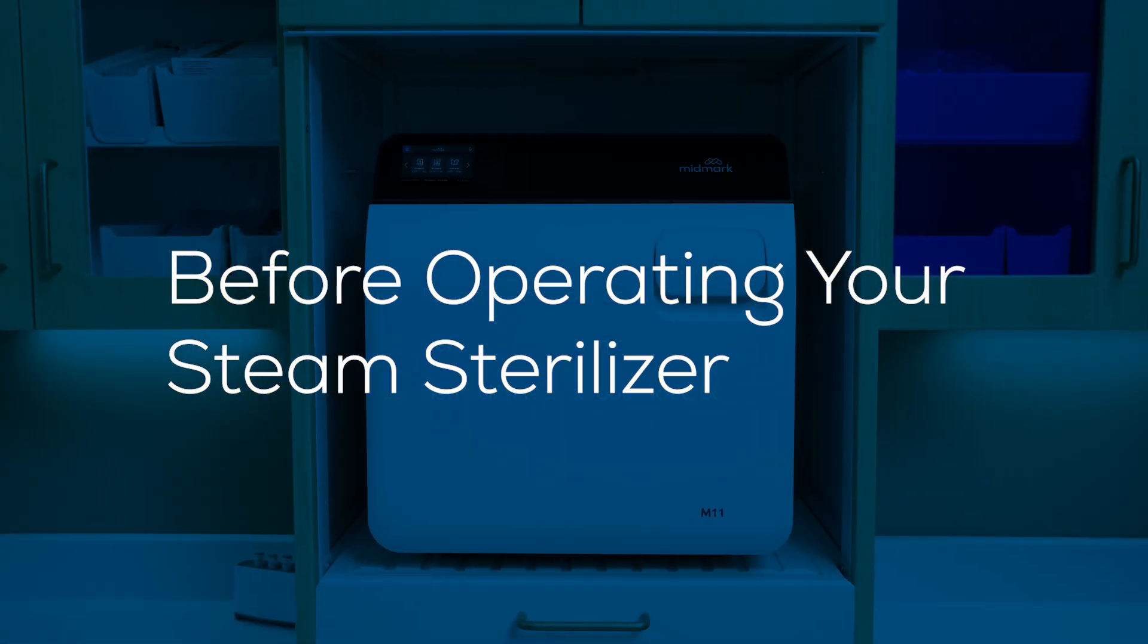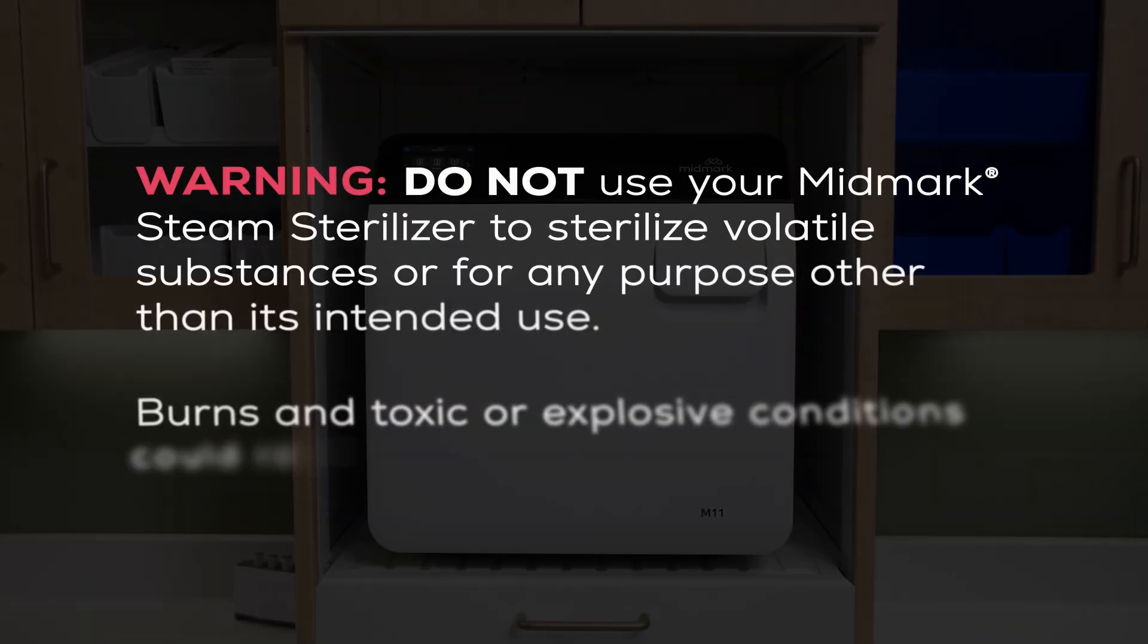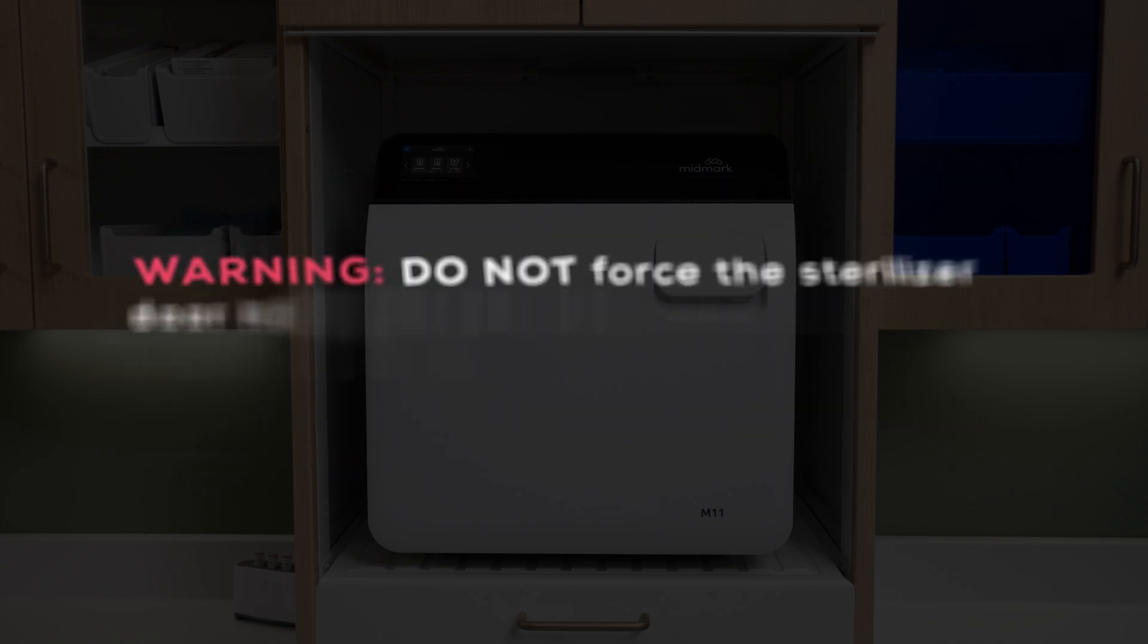Before operating your steam sterilizer, here are some things to keep in mind. Do not use your Midmark steam sterilizer to sterilize volatile substances or for any purpose other than its intended use. Burns and toxic or explosive conditions could result.